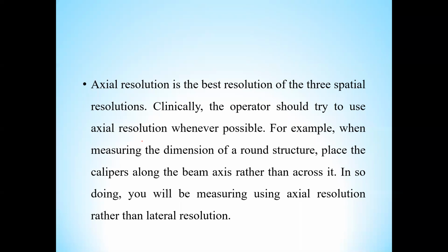And clinically, the operator should try to use axial resolution whenever possible. For example, when measuring the dimension of a round structure, place the caliper along the beam axis rather than across the beam axis.